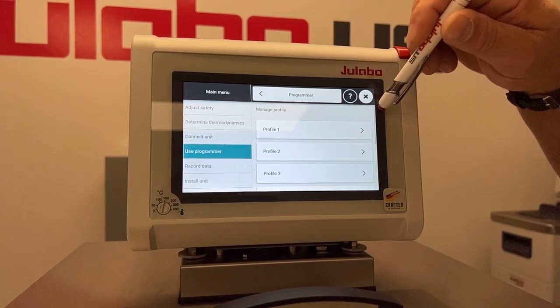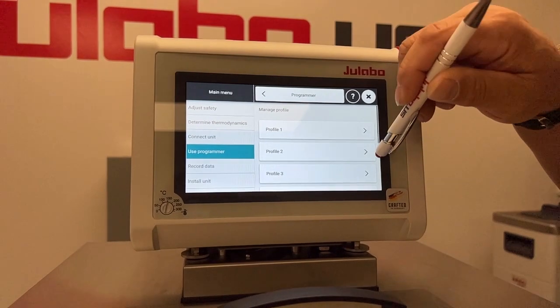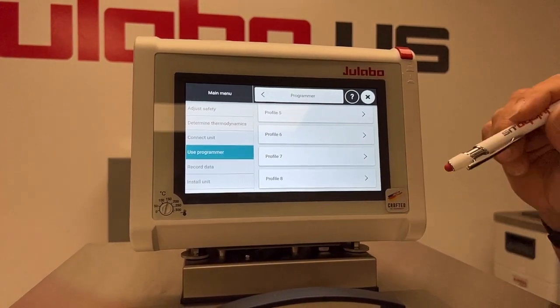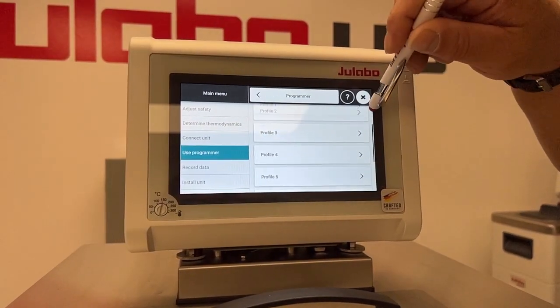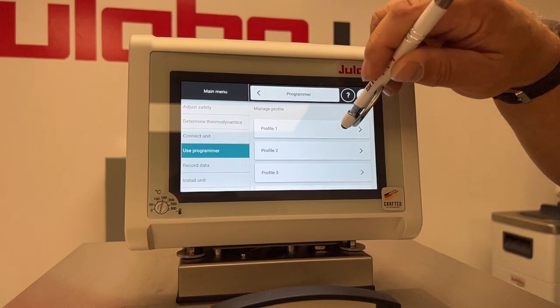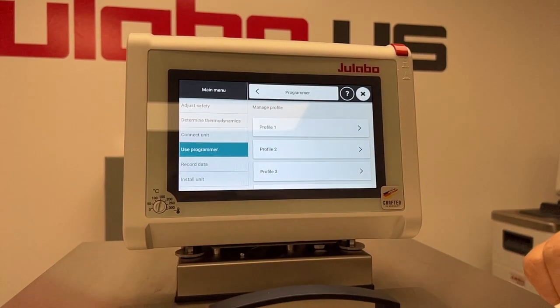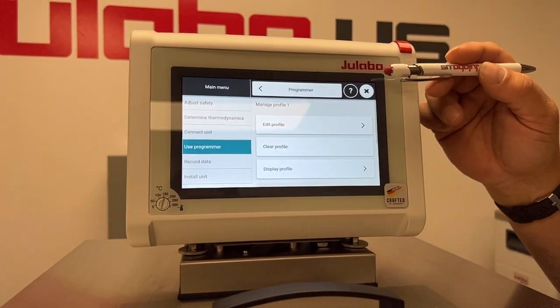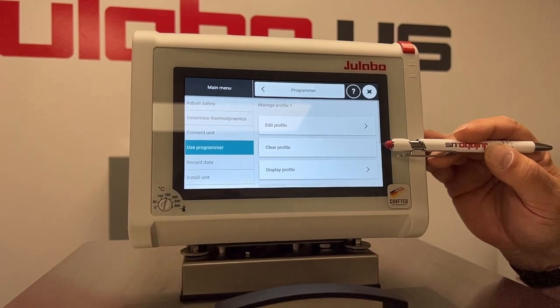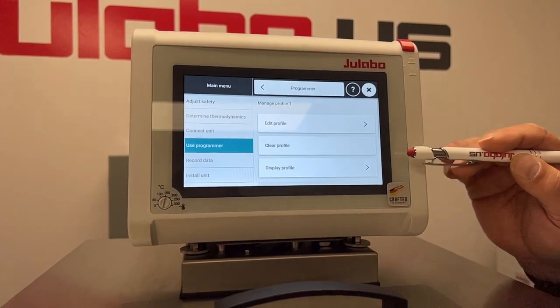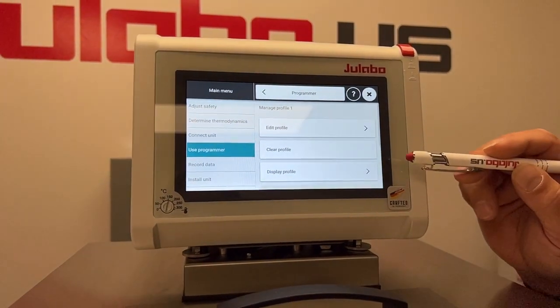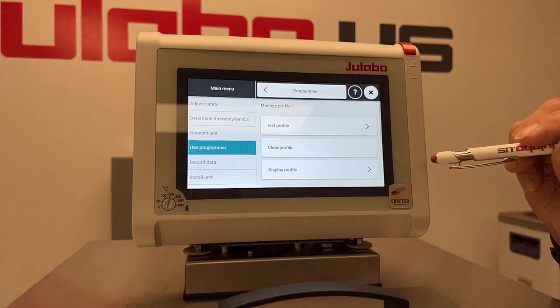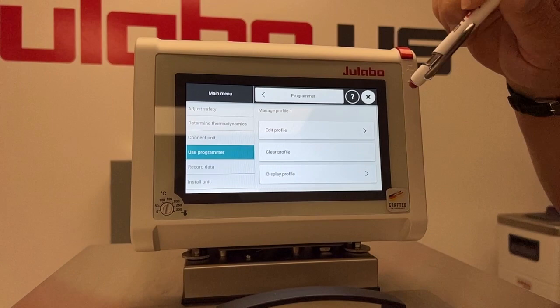There are eight profiles that can be programmed with up to 60 steps each. So we'll select Profile 1. You have several options here: Edit, Clear a Profile if you have it already programmed, or Display, which will give you a graphical display.